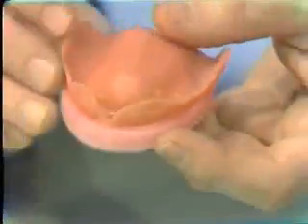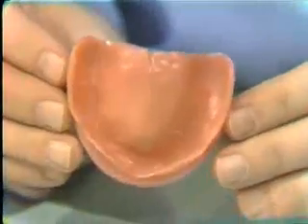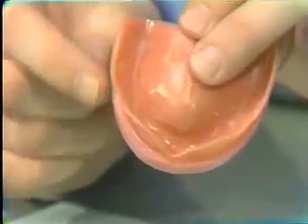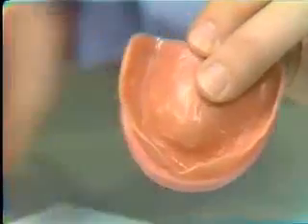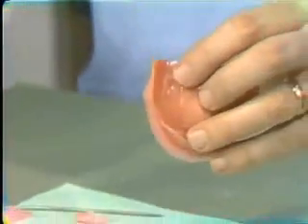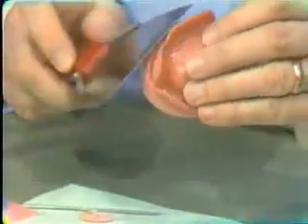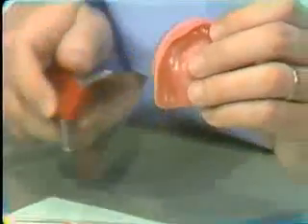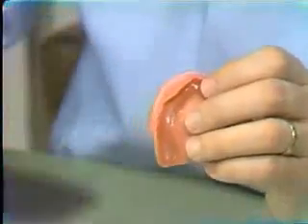Now, looking down on the tissue surface of the base plate, you really shouldn't see any wax extending over the periphery. If that is the case, you're probably a little too wide. Now, I'm not going to continue this at this time because I have one made up that we can continue with the tape. I just wanted to point out the contouring of the anterior portion.